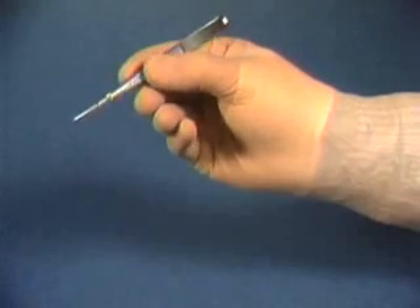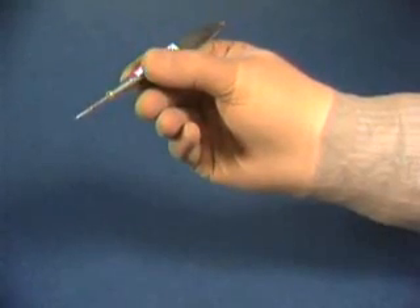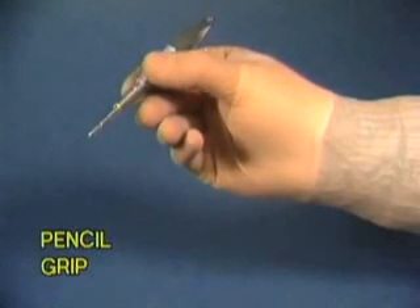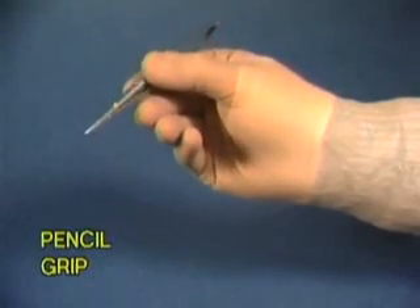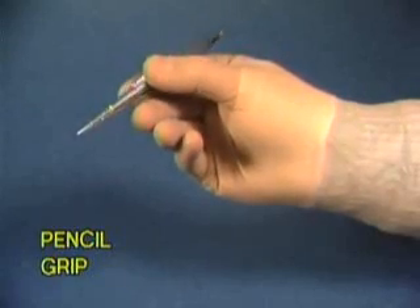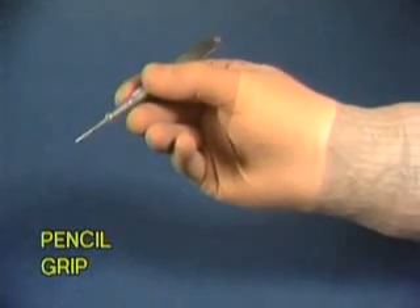The pencil grip is the most delicate and accurate method of suturing. This grip is best used with the Castroviejo needle holders, and the needle can be advanced through the tissues only by rotating the holder between the index finger and thumb.